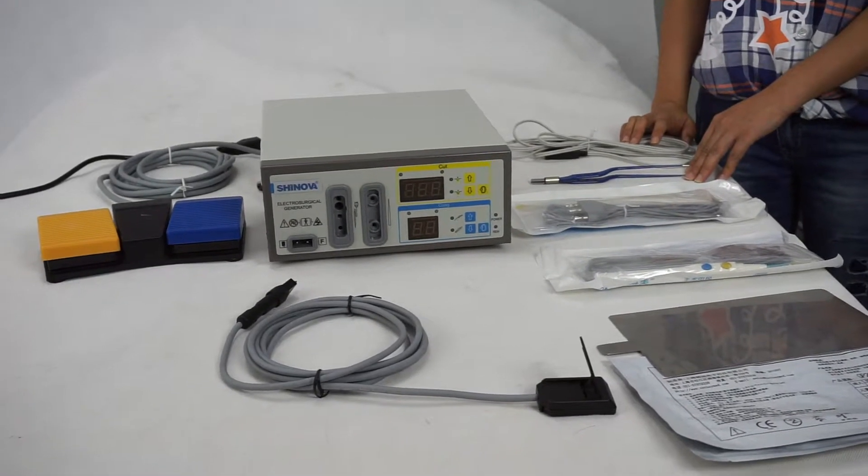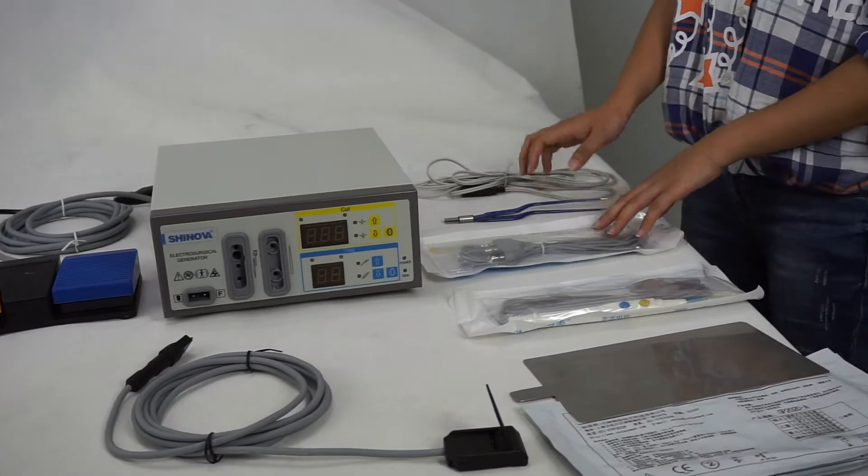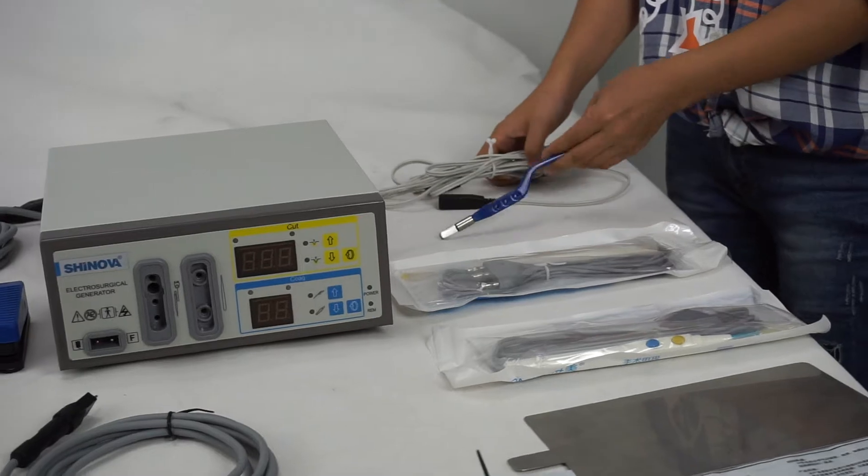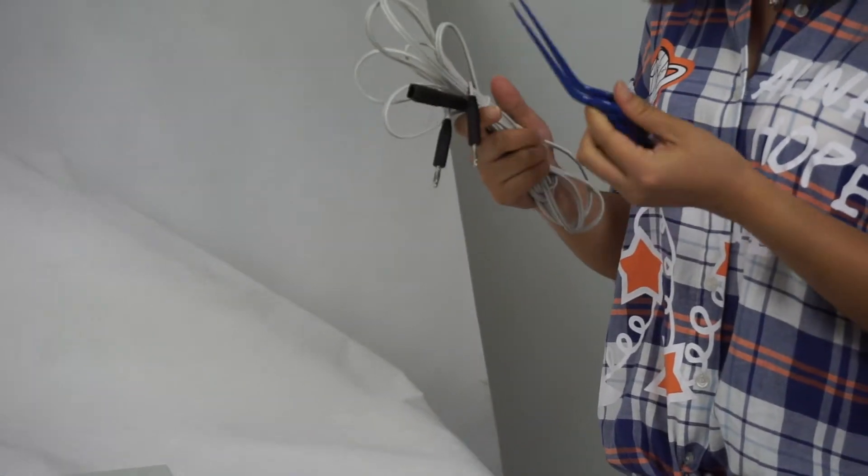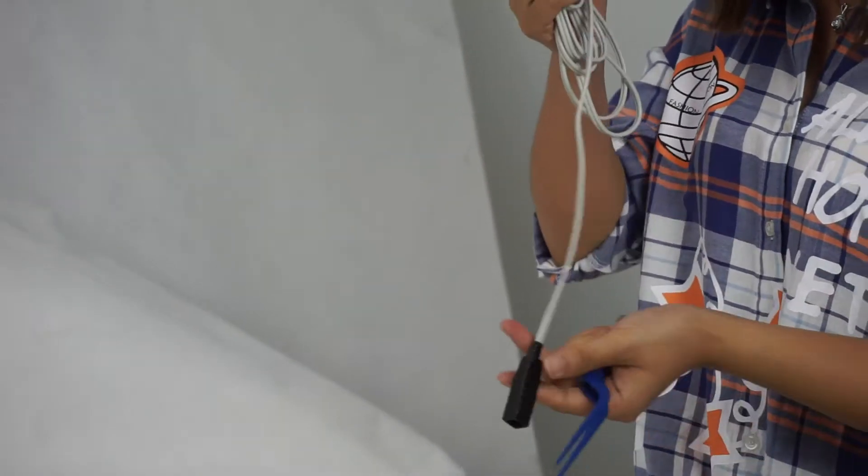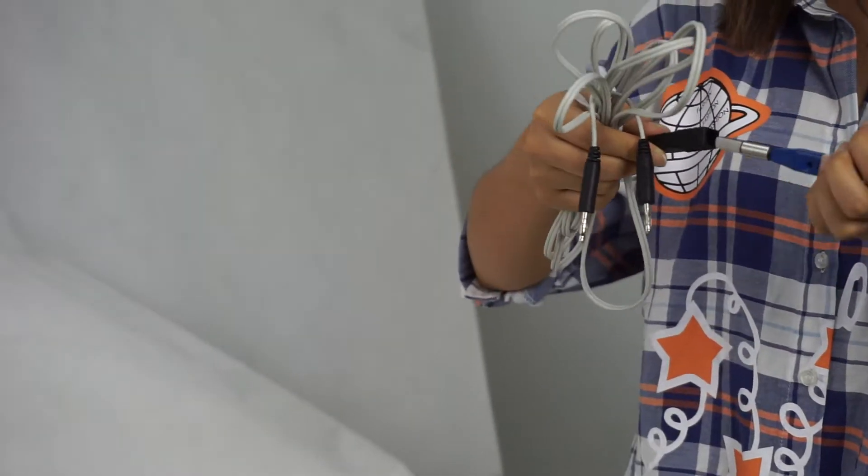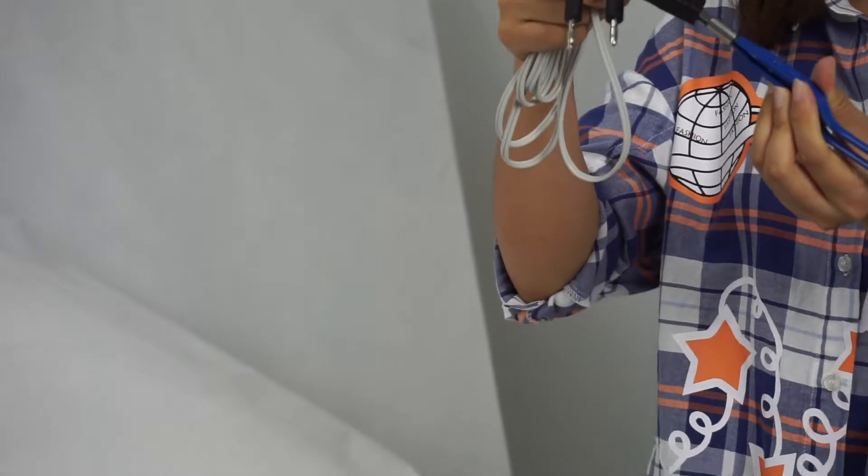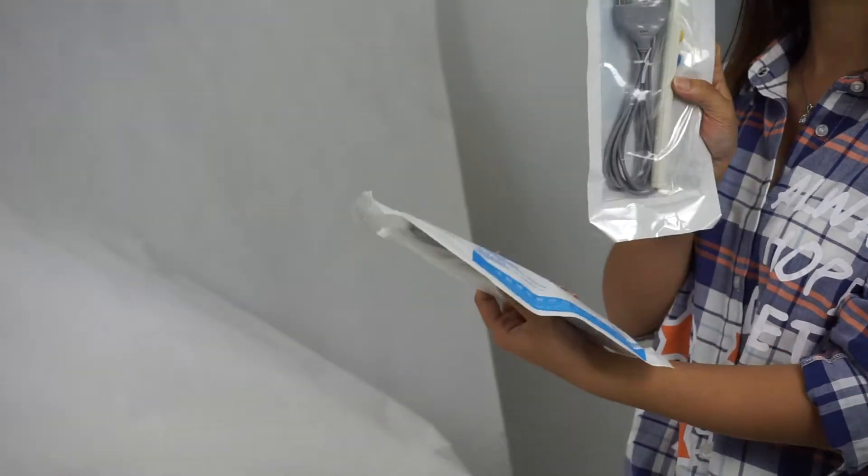It consists of the main unit and accessories. Now let's take a look at the accessories. This is bipolar forceps and the cable is connecting the forceps like this way. And next, the disposable electrosurgical pencil, tool piece.